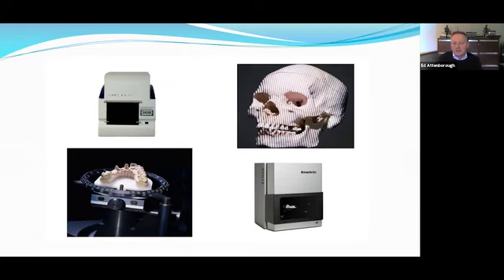The advantage of structured light scanning is that, of course, we've got lots of lines cast onto the object in one exposure, or position of the gimbal that's rotating the object under the projector and cameras. So the speed of data acquisition is much faster.